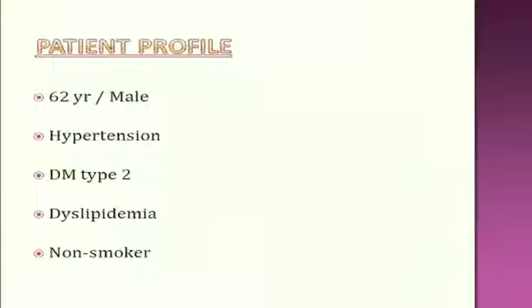Yeah, good morning. So I have with me the team and a complex PCI bifurcation to handle. So Dr. Tomar is going to introduce the case to you and then we go ahead. Okay. So this is a 62-year-old gentleman.